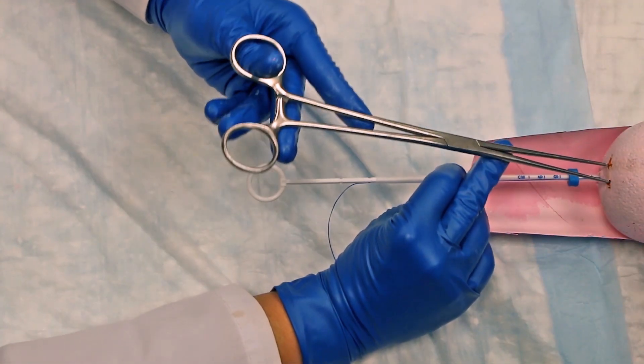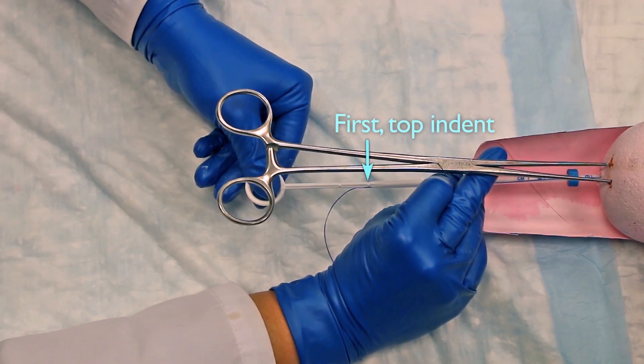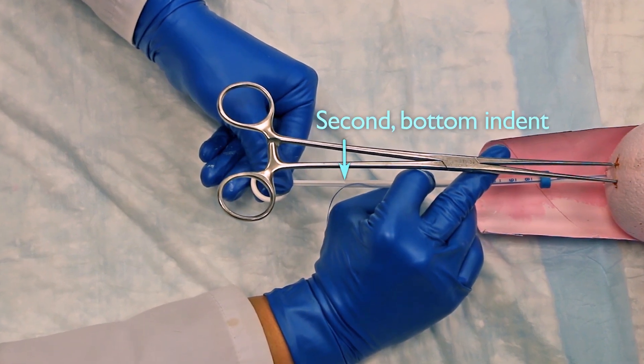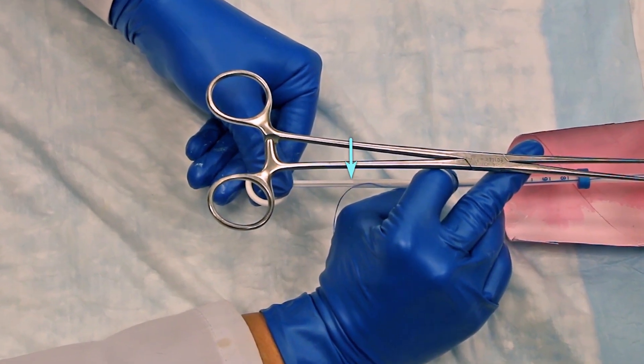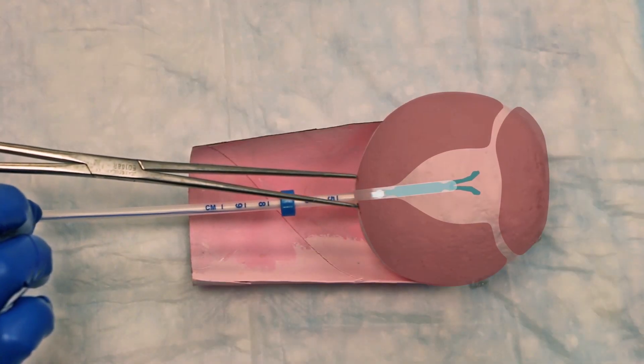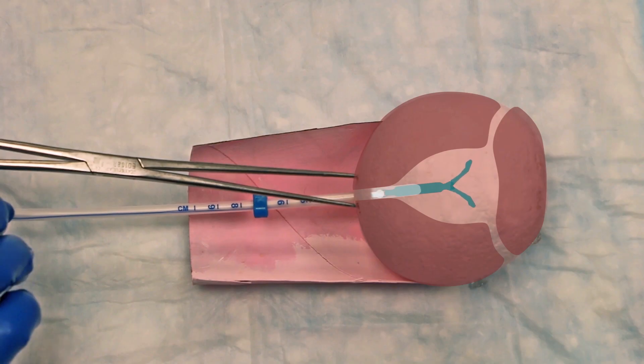Next, gently release your hold on the tenaculum and grab the ring of the rod to hold it steady. To release the arms of the IUD from the insertion tube, gently pull back the insertion tube to the bottom second notch in the rod. This allows the arms of the IUD to expand in the lower uterine segment. Wait 10 to 15 seconds for the arms to fully open while holding the insertion tube and rod steady.